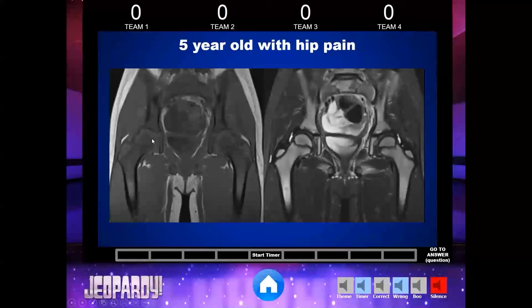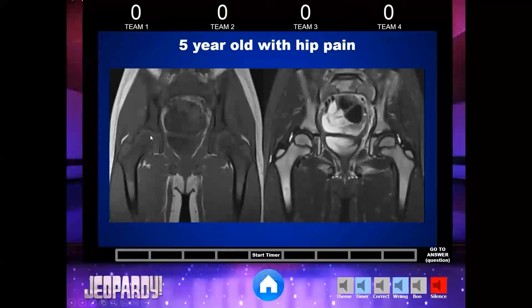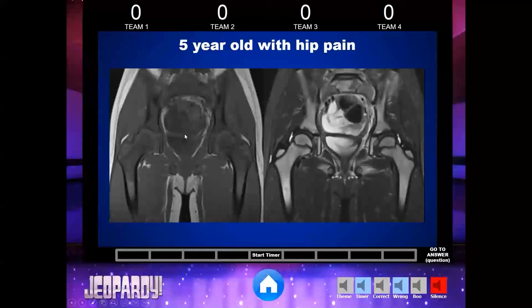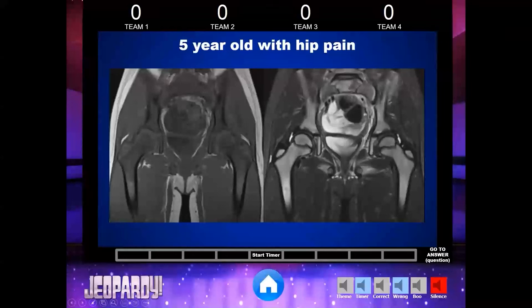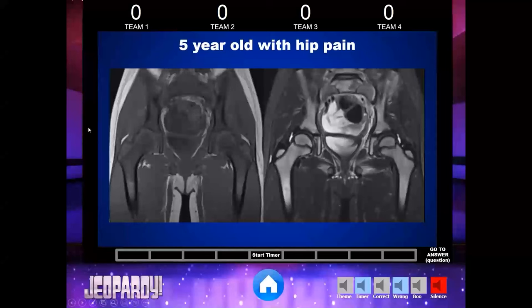In peds, another hint is to look for areas where you expect to see fatty marrow. Even in someone with hyperactive red marrow, the epiphyses and diaphyses are usually still fatty. Dark epiphyses on T1 should make you think this is concerning for a marrow replacement process. I'm working on a fat fraction technique — similar to liver fat fraction — to put a region of interest and give a percentage. I have a paper in Pediatric Radiology showing leukemic cases are typically below 10% fat fraction. If you have marrow infiltration, the fat in the marrow goes down — that makes it a little less subjective.